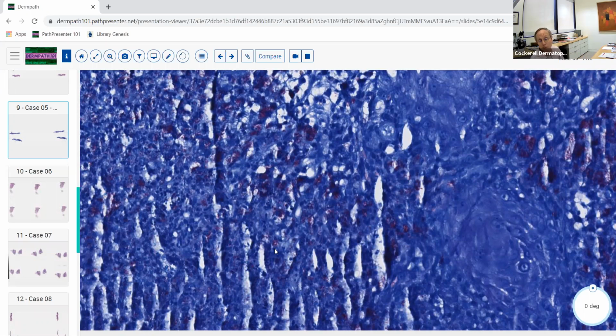The general rule of thumb is the more granulomatous inflammation, the greater the inflammation, the lesser the organisms, which makes sense because the host is coming in and getting rid of them. But in some cases like here, I mean, this might have been an AIDS patient, might have been an MAI.